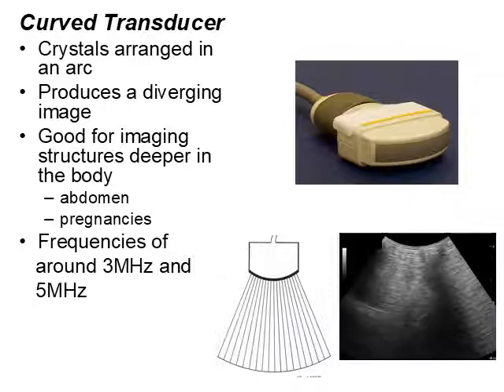Now again, these transducers will be multi-frequency, so they'll work at multiple frequencies, but one will be around the 3 megahertz, it might work at 2, 3 and 4 megahertz, and then there'll be one that will be at 5 megahertz, which might work at 4, 5 and 7 megahertz. If I was to do an abdomen on a child, I would be able to use my 5 megahertz transducer, because I wouldn't need as much depth, but I would like the extra detail.